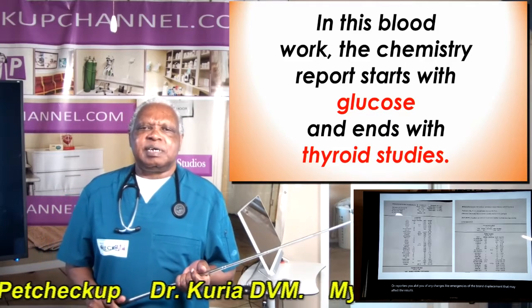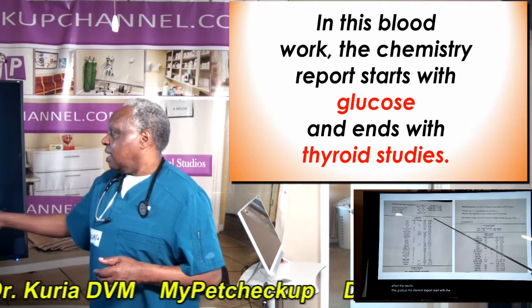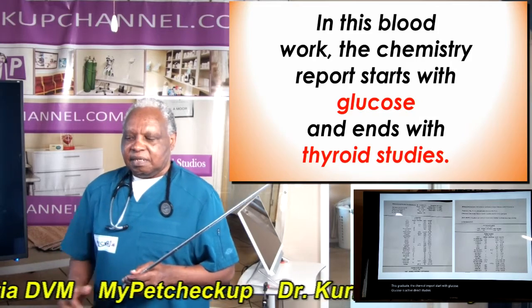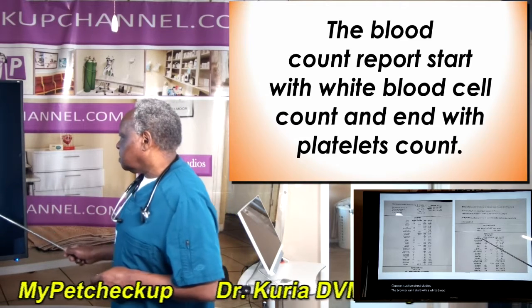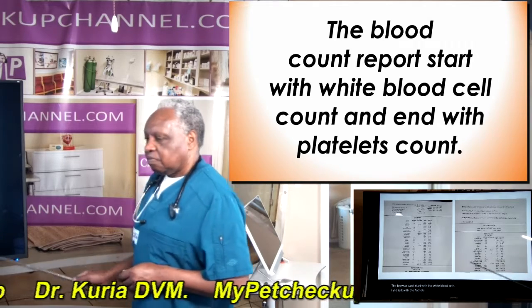In this blood work, the chemistry report starts with glucose and ends with thyroid studies. The blood cell count starts with the white blood cells right there and ends with the platelets down here.